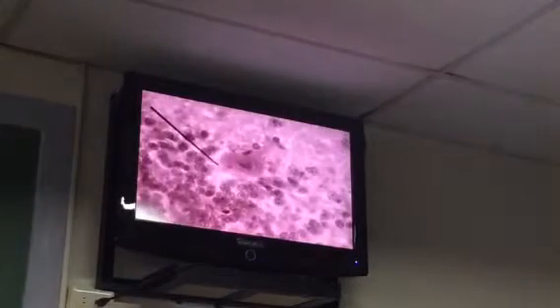And you see those large cells. See, these are large cells. These are now your Purkinje cells, and it's best to see them under high power. Those cells, by the way, are the neurons or nerve cells. In the same way, the Purkinje cells are also neurons.